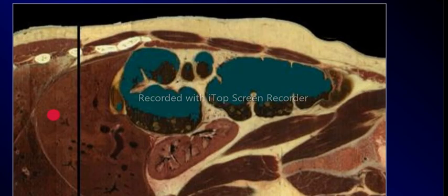So you can see this is the dome of the diaphragm. This one there, going down, all the way down up to here. Okay, this is the dome of the diaphragm. Continuing down here. What we mean by posterior recess is the fact that this diaphragm goes all the way down here. So there's this space, and this is still lung tissue.